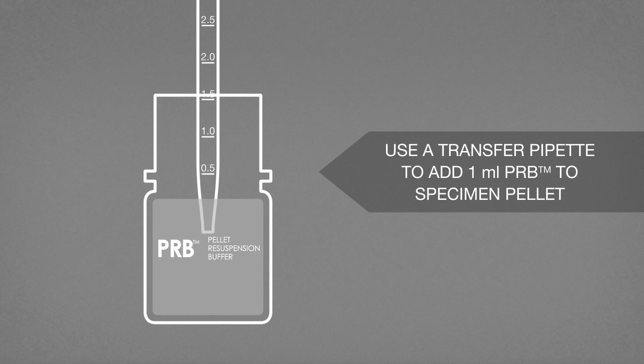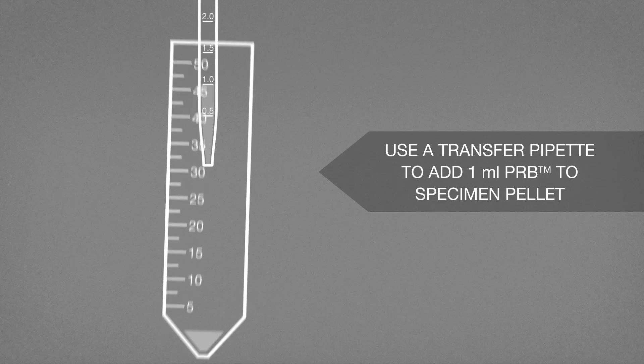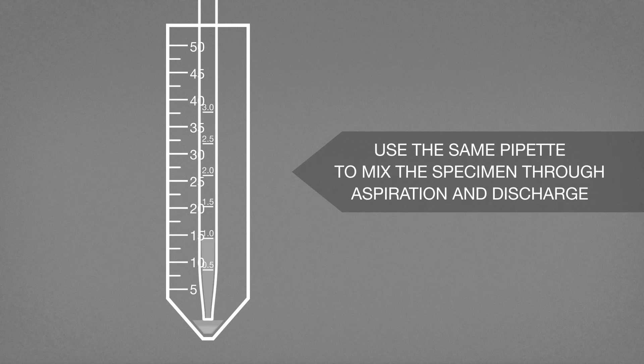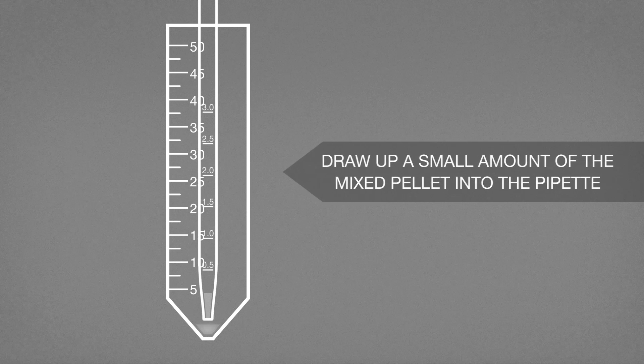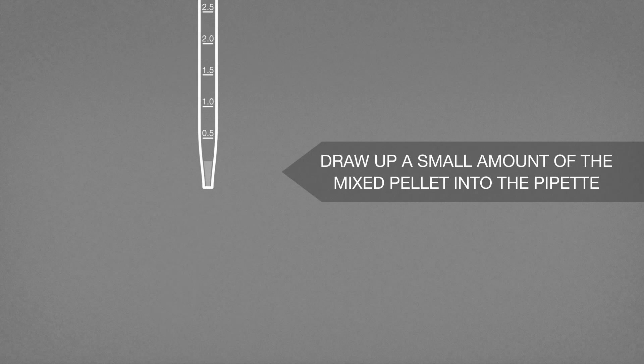Using a transfer pipette, aspirate 1 ml of PRB and add to the specimen pellet. Using the same pipette, carefully mix the specimen through gentle aspiration and discharge. Draw up a small amount of the mixed pellet into the pipette.